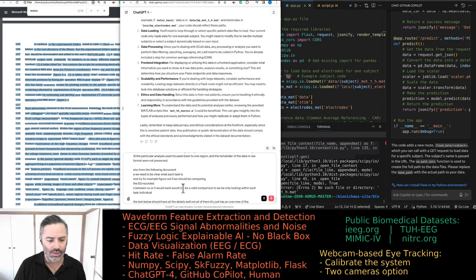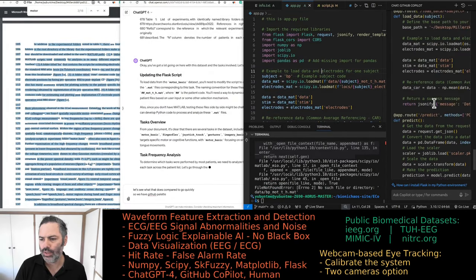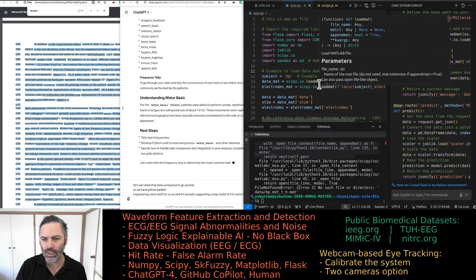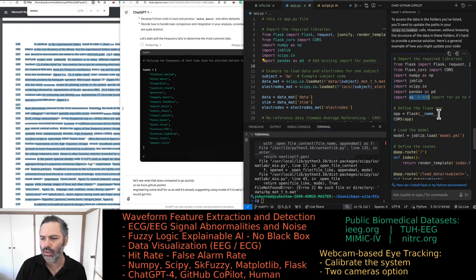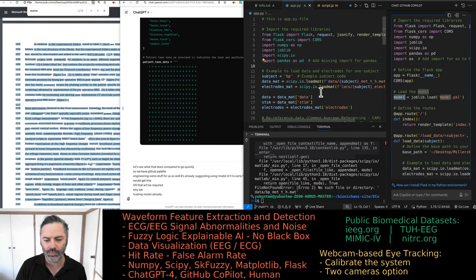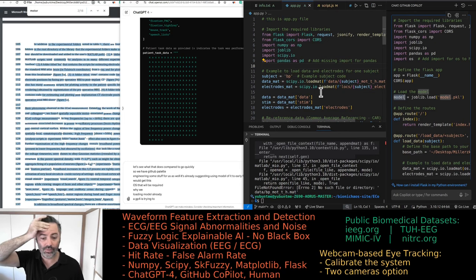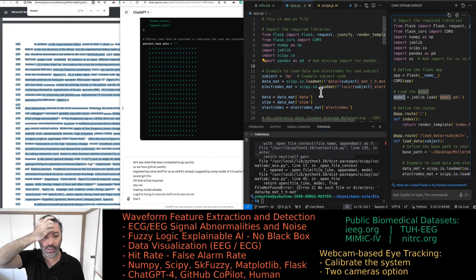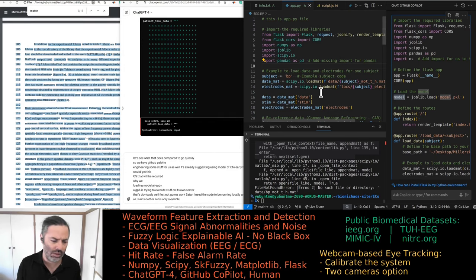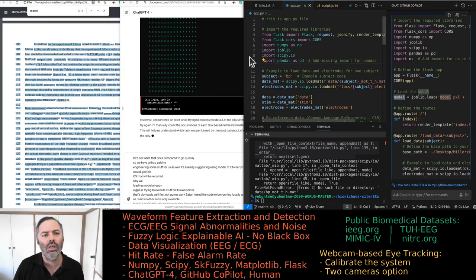The text below should have all the details — well, not all of them. It just has an overview of the tasks in general, because there is data specific to each task. GitHub Copilot is already generating some stuff for us as well — it's already suggesting using a model, which I think is too early for that. GPT-4 is trying to execute stuff on its own server, which is obviously not going to work. I need the code running locally anyway, and the dataset is only available locally.